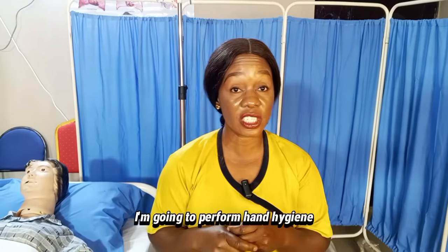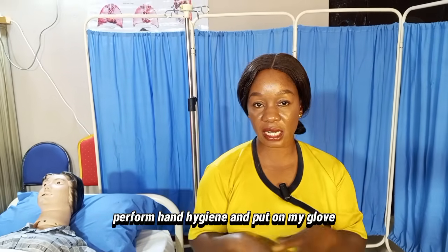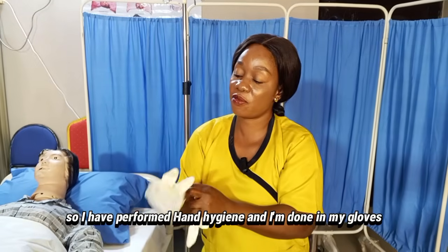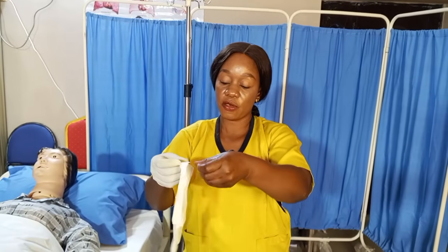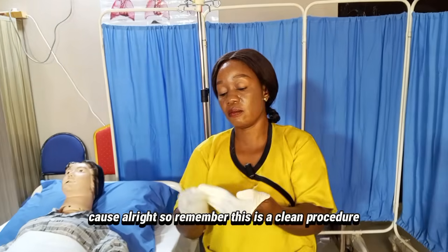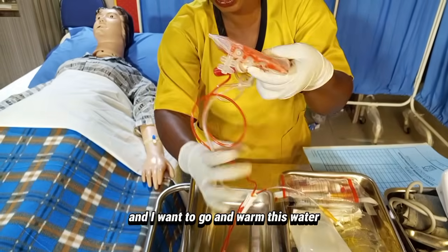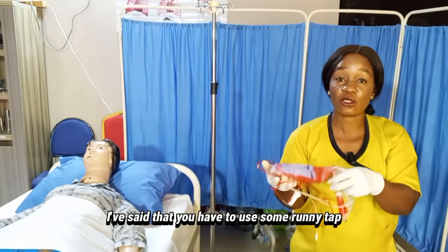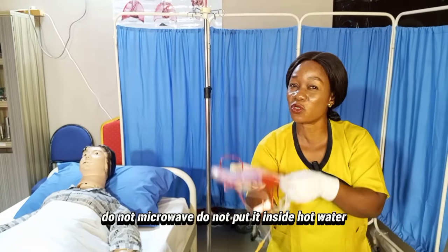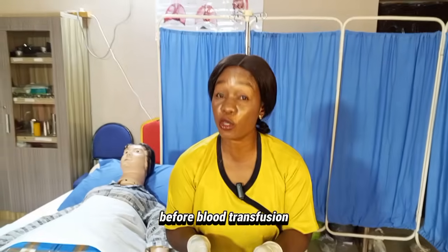Perform hand hygiene and put on your gloves. Remember, this is a clean procedure. I've donned my gloves and I'm going to warm the blood to room temperature using running tap water. Remember: do not microwave the blood and do not put it inside hot water. We are still on the responsibilities of nurses before blood transfusion.